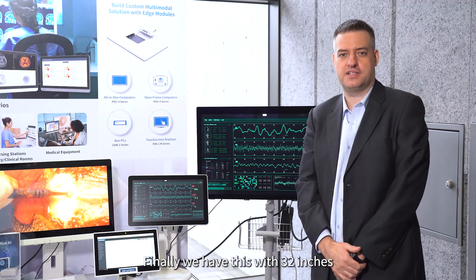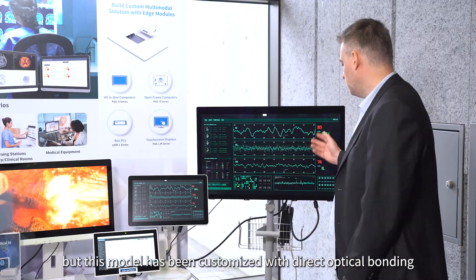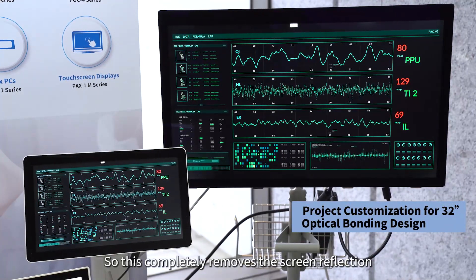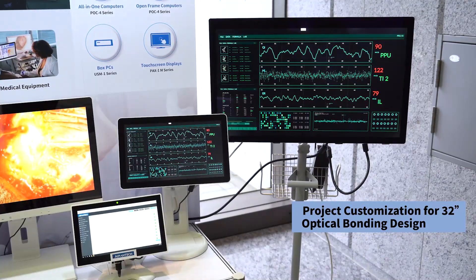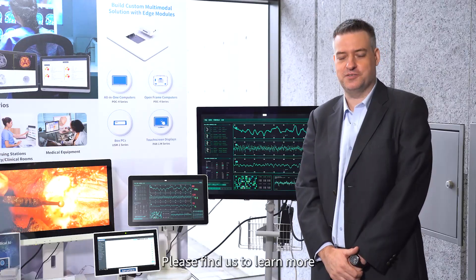Finally, we have this 32 inch which is based on our PAX3 surgical display, but this model has been customised with direct optical bonding so it completely removes front-of-screen reflections. This special version of PAX3 also has more advanced DICOM options, so PAX can help you for all your medical display needs. Please find us to learn more.